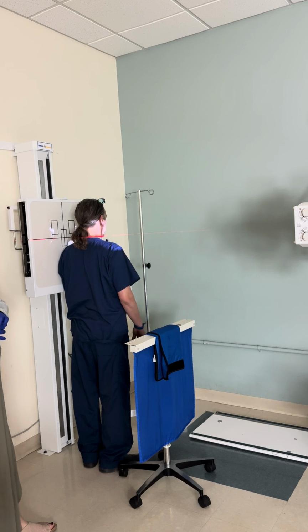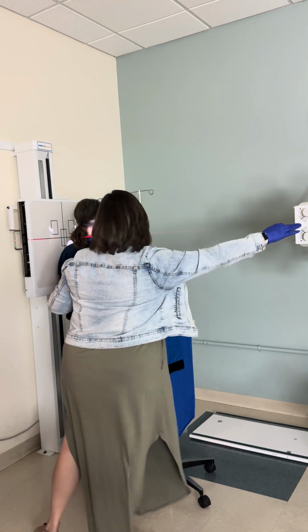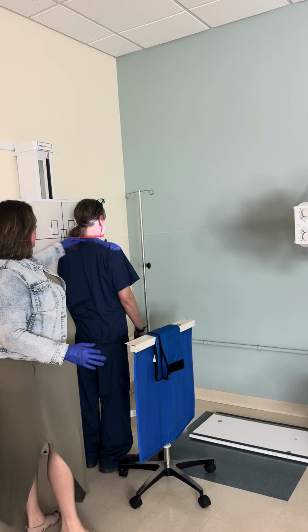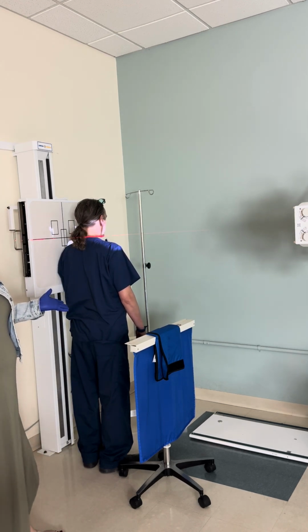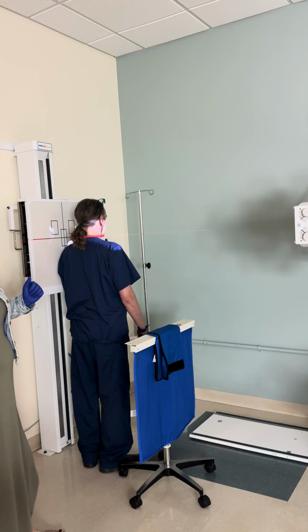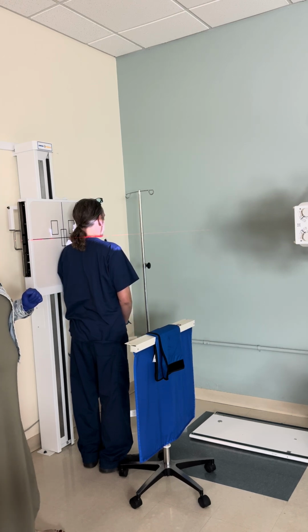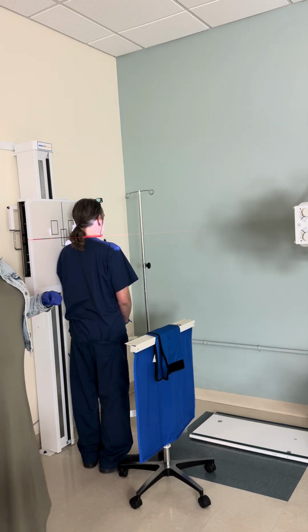Questions about that one? Okay, so still at C4, make sure we have the EAM, make sure we're seeing below the C-spine, which we know C7 is here. So as long as I have light coming below that, then we're seeing part of the T-spine. Okay. And these are all 10 by 12? All 10 by 12 for the C-spine, yes. Okay. So those are the three views for the C-spine practicum.